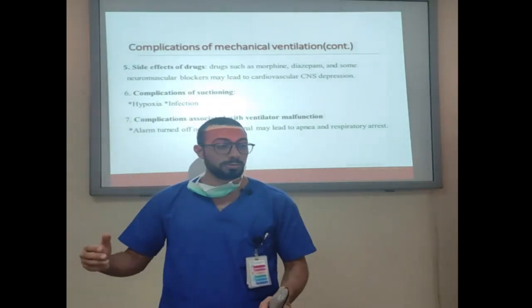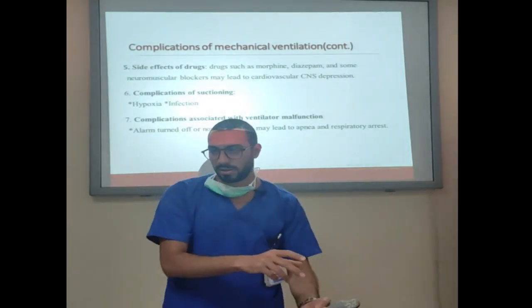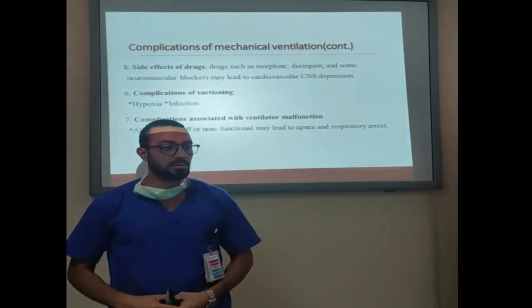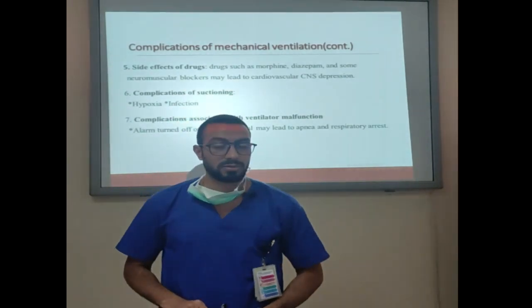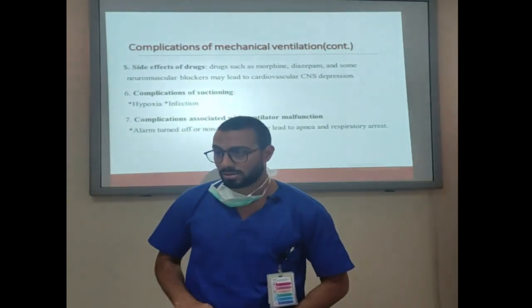We have what's called UPS, uninterrupted power supply, and we have another power supply. With the normal power supply, if we have an electricity shutdown, it will not support the ventilator with electricity. If the battery is not good, you will have a shutdown for the ventilator.